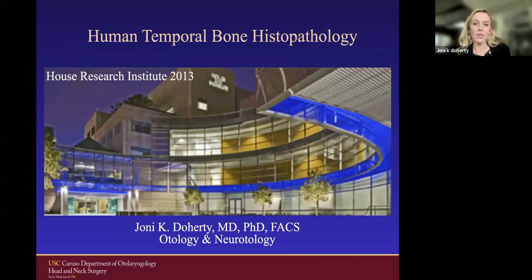But this research that I'm going to present is from many years, going back to when Joe Fayad was with the lab, and Fred Linthicum was my mentor. So I just want to do an overview of what we learned about cochlear implants through the years through histopathology.